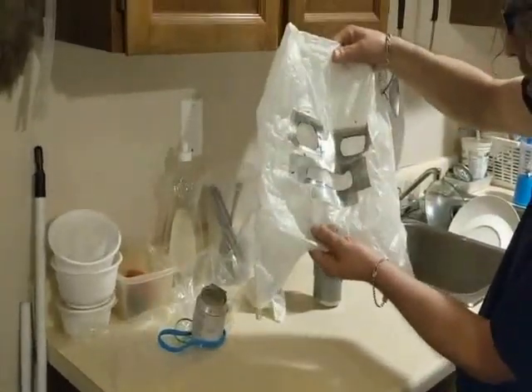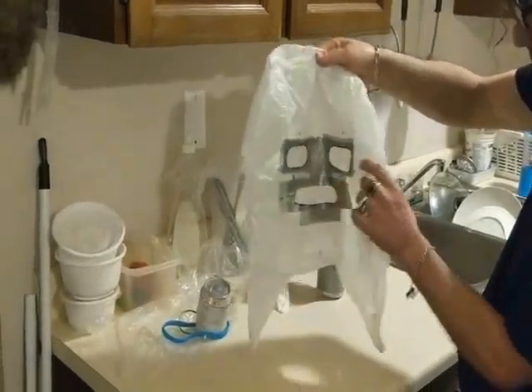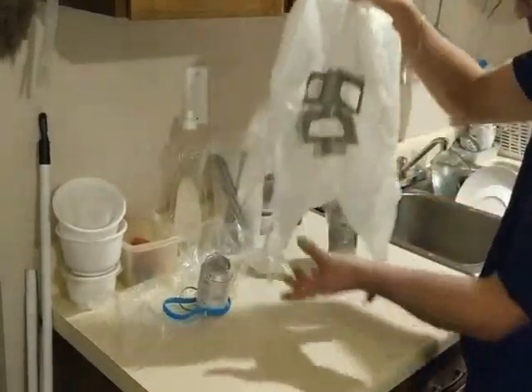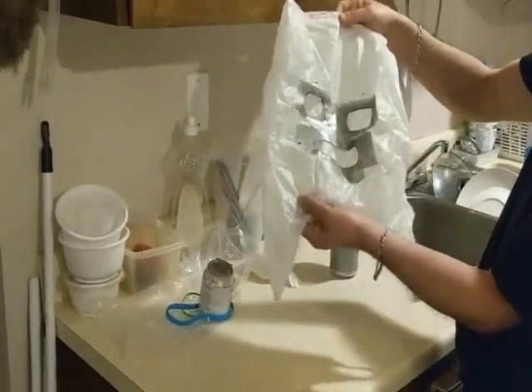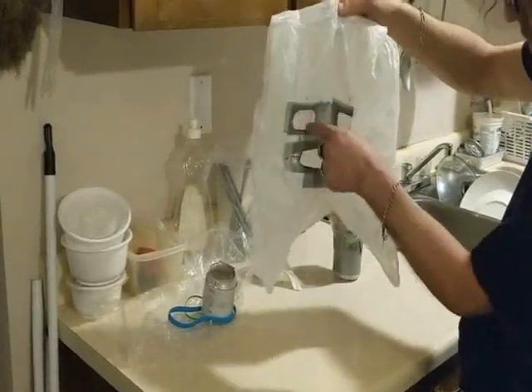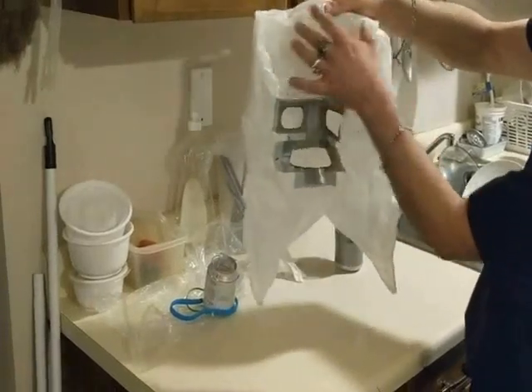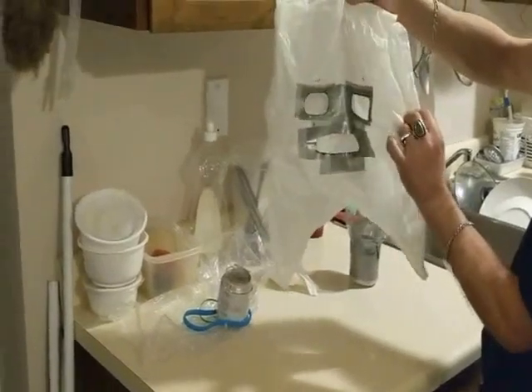That'll go over top of your head. That's protecting your face, along with your N95 mask, your filtration mask, or your shield mask. Just like as you see on the news, as the surgeons and the doctors are wearing. They are covered up. So if you want to make a jacket or pants, you can. But I'm showing you how to make the head plastic mask. This is for your whole face now.